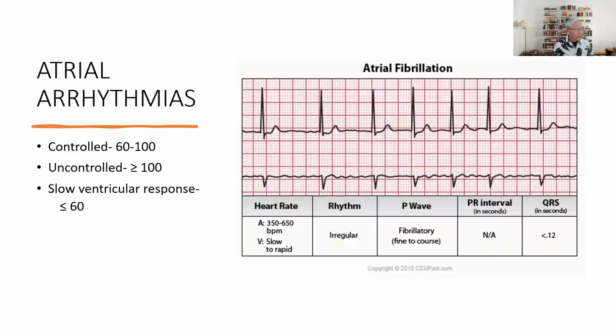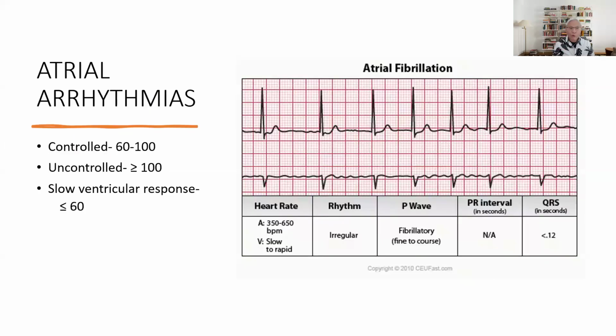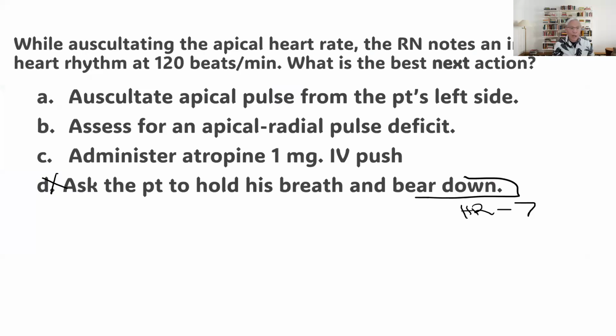And notice over here, is your rate over 100? No. The other one, is your rate over 100? No. The atria is the one that's having the quivering. It's not the ventricles, okay? So therefore, that would not be a correct answer.